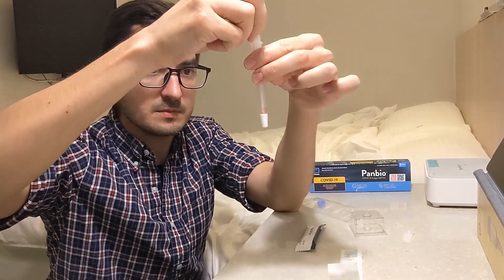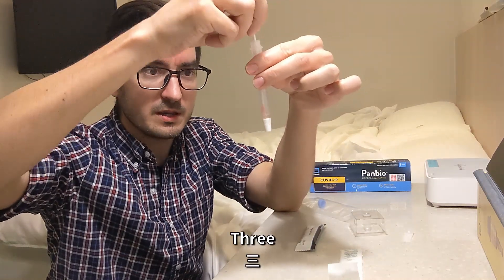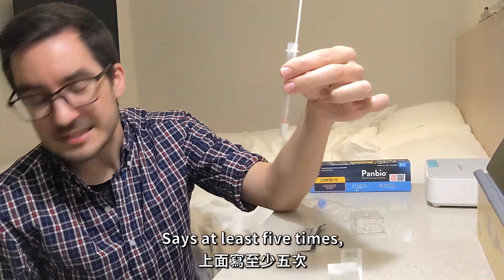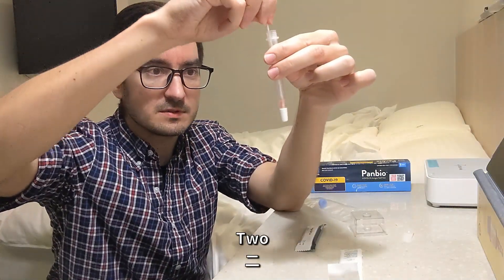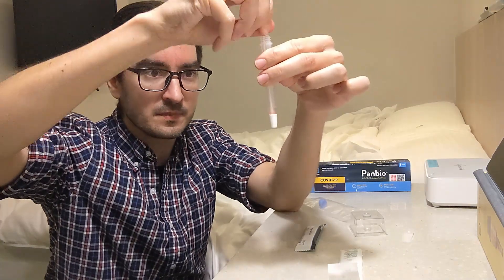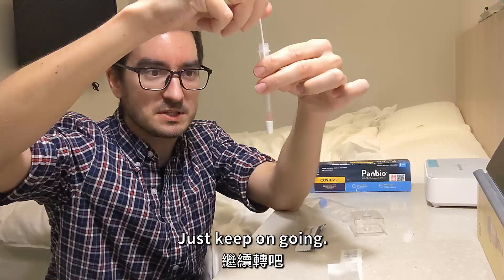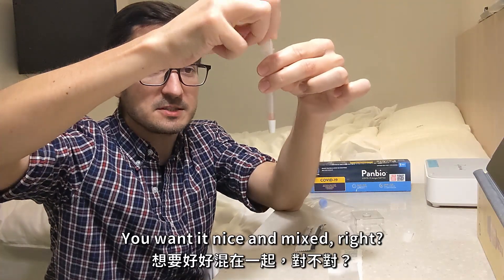One, two, three, four, five — at least five times, so let's keep going. You want it nice and mixed.